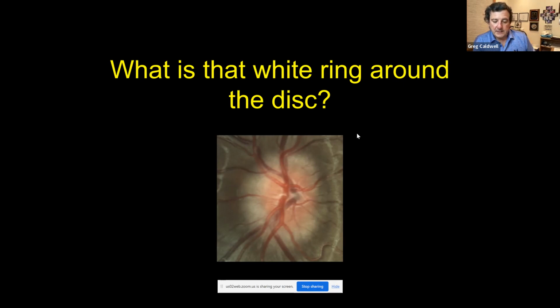But, you know, that came out like 2000, 2002. We're 2 decades into it, and we're still kind of wondering if there's a neuroprotective property. 2 decades into it, there probably isn't. I'm not saying that's without merit, I'm just adding that kind of commentary.